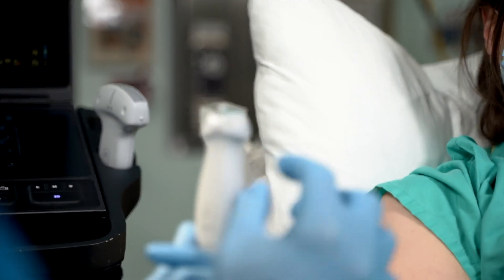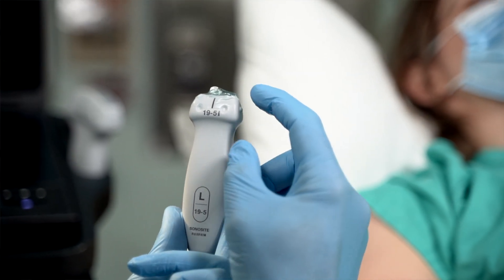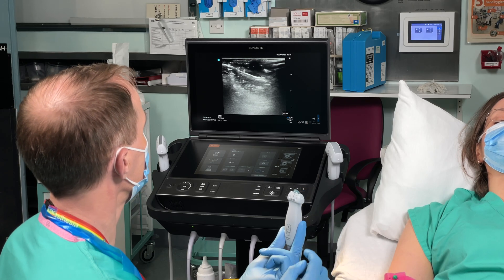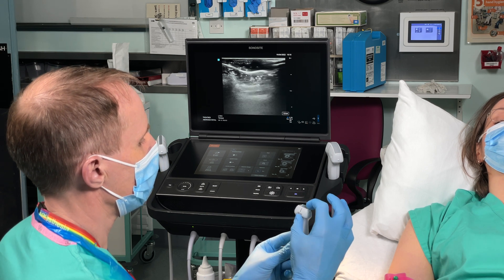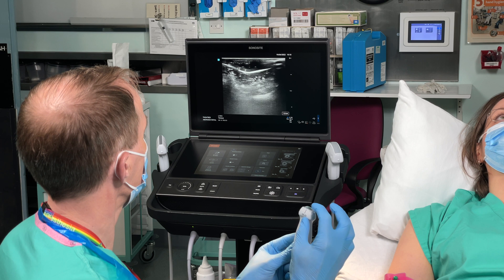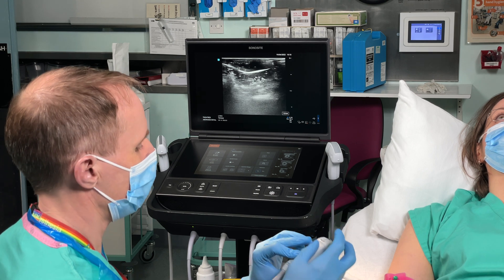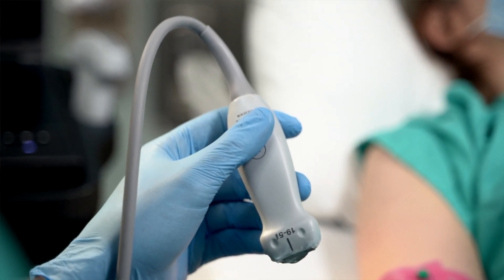To check your orientation, put some jelly on the tip of the probe and tap the tip of the probe with your finger. You will see a corresponding movement on the ultrasound screen on the side of the probe that you're tapping. This means that your left will be the screen's left and your right will be the screen's right, which will help when you're trying to steer your needle under the patient's skin. Keep the vessel you intend to access in the centre of the screen and use the mark in the centre of the probe to help guide your needle insertion.